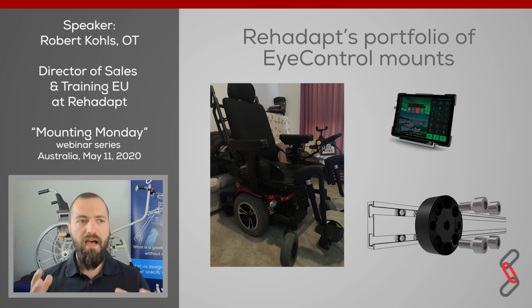So this is how we see a wheelchair when we are getting, for example, a VMS request. We are seeing a power chair. We're seeing that there are some footrests. We are seeing the control unit on the left side of the wheelchair. And we now need to choose the right mounting solution for a Tobii iMobile for that customer.